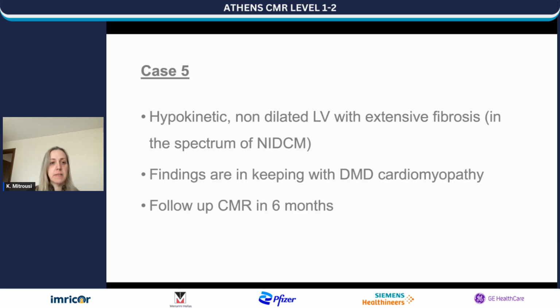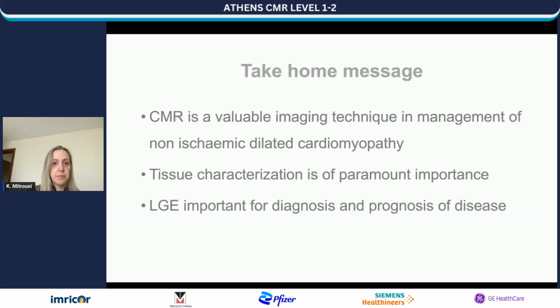And the findings here are a hypokinetic, non-dilated LV with extensive fibrosis in the spectrum of non-ischemic dilated cardiomyopathy. Findings are in keeping with Duchenne muscular dystrophy cardiomyopathy, and he has been referred for a follow-up cardiac MRI in 6 months' time.